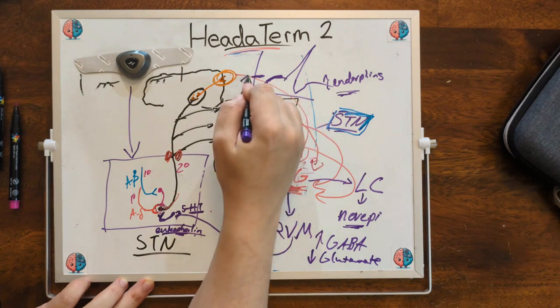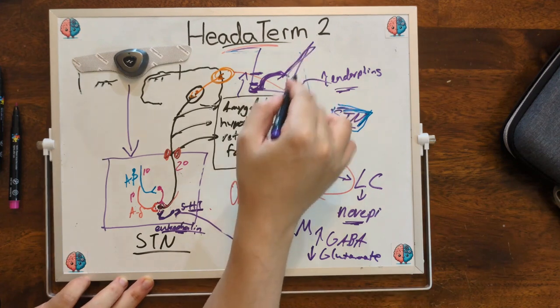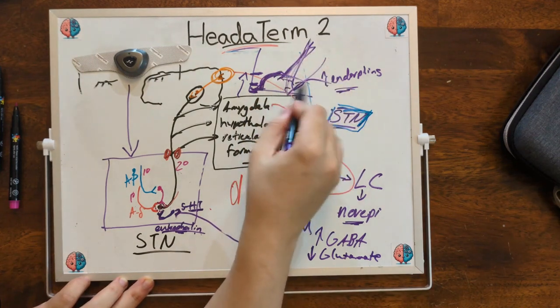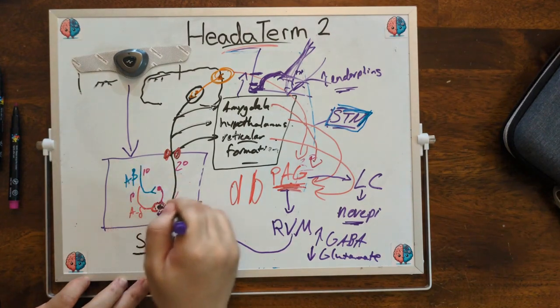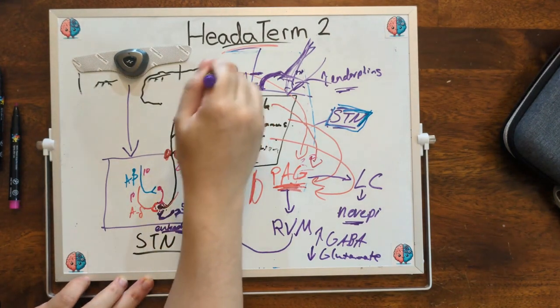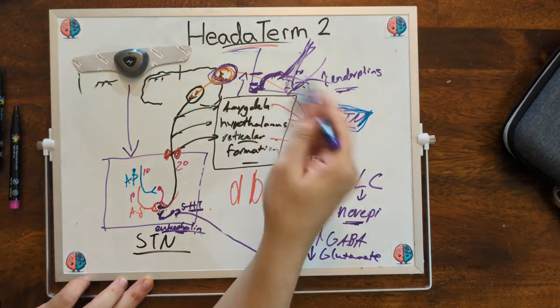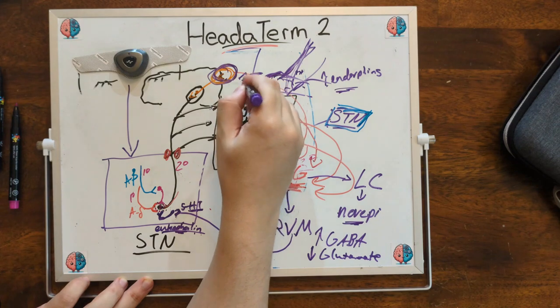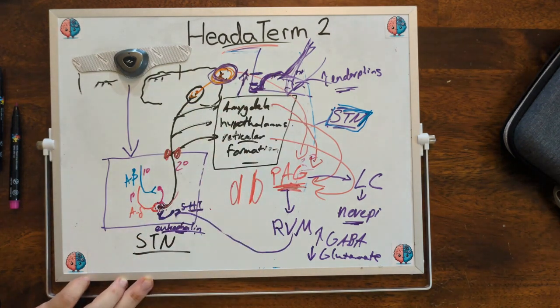We want to increase that threshold, so it takes a lot more stimulus for the action potential. We won't feel pain without the action potential. We need the electrical signal to go through these three neurons so we can consciously, unfortunately, process pain in the cortex. Without this signal, we won't feel pain. And therefore, if we increase the threshold, we prevent this electrical signal from traveling up this pathway.